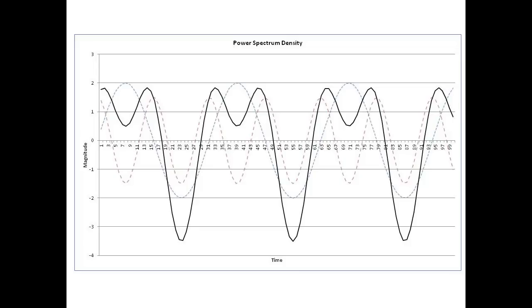What we do is we utilize a technique called power spectrum density, where we break down a wave into its component waves. All component waves are sub of the wave.